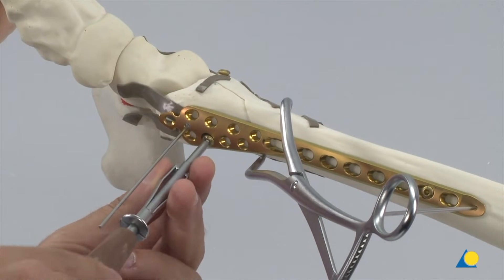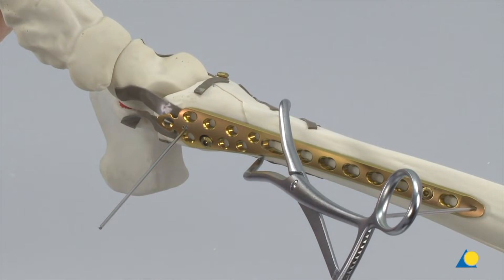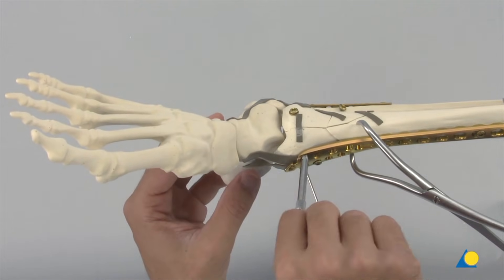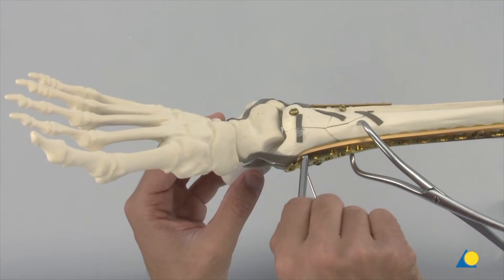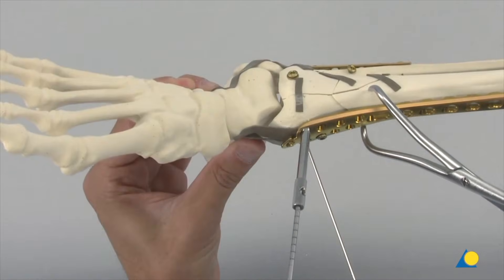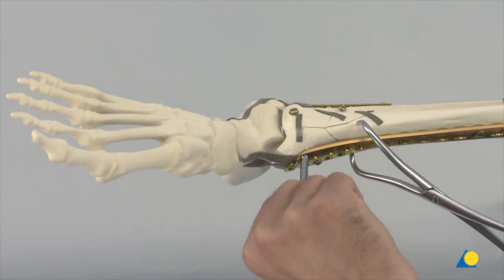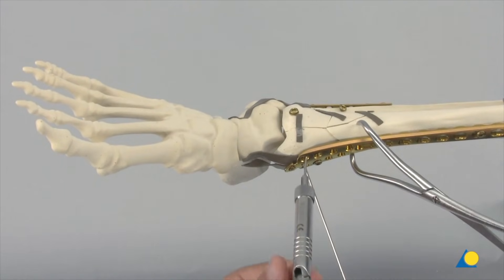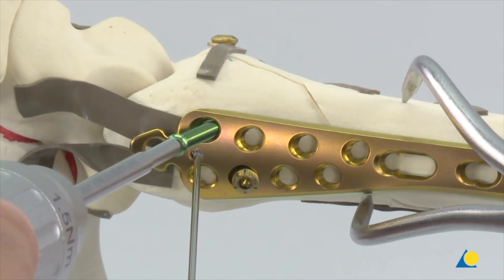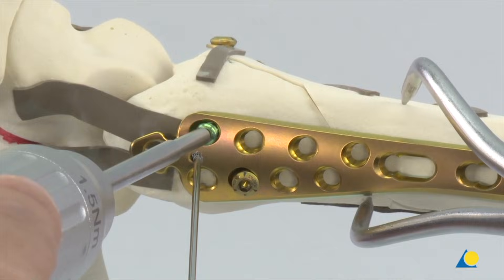Ensure that the fragments are aligned in the relevant views. The locking screws are inserted at this stage. The LCP drill sleeve 3.5 for drill bits 2.8 mm diameter is placed distally onto the LCP plate. The hole is drilled with the 2.8 mm drill bit, the drill sleeve removed, and the hole is measured with the depth gauge. The 3.5 mm locking head screws are inserted primarily with the power drive, however they are not fully seated.